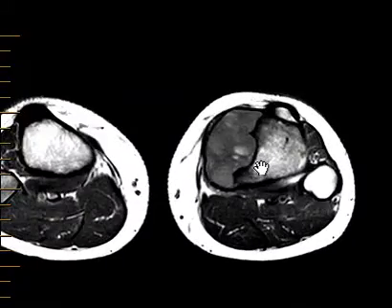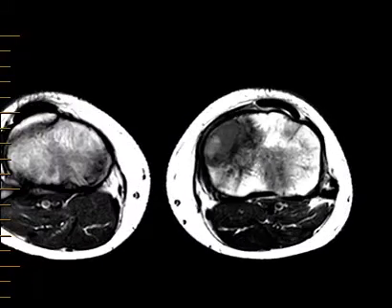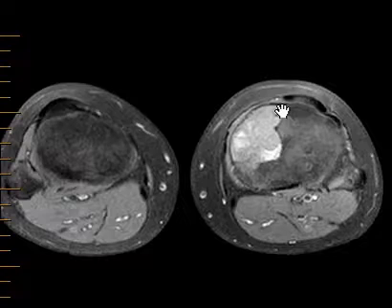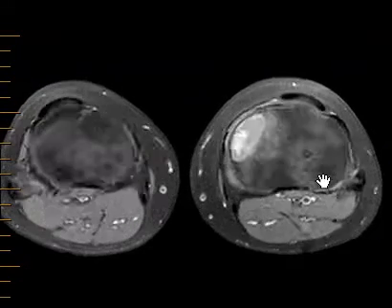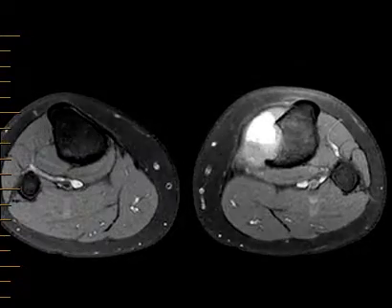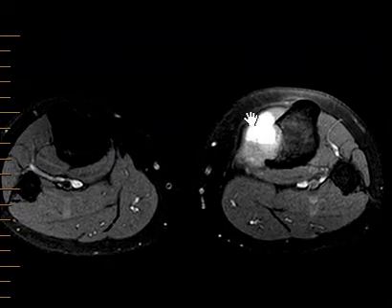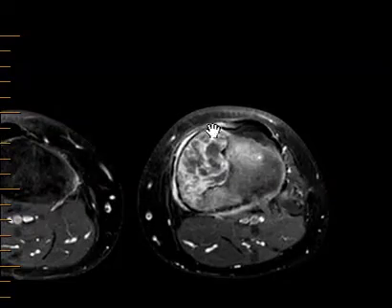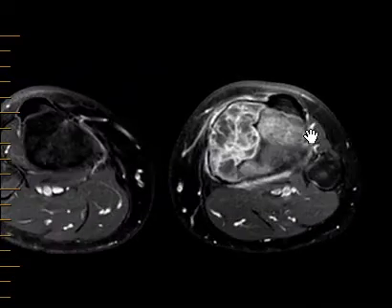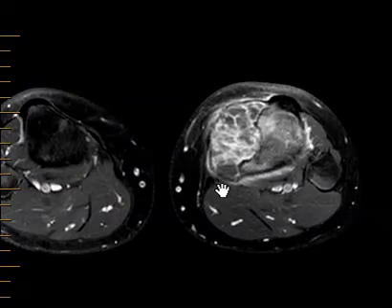That leads us to think this may be a benign lesion. Here is another sequence — this is the same as the other one but now we suppress the fat. It's called a fat-suppressed T1 image, and all the fat is made dark. We see that bright pocket of fluid, which is hemorrhage, and the margins again are sharply defined. With IV contrast we see that this does have enhancing septations throughout it.